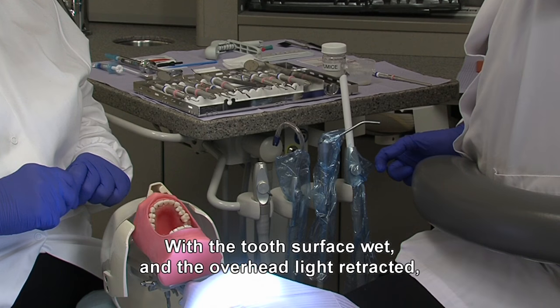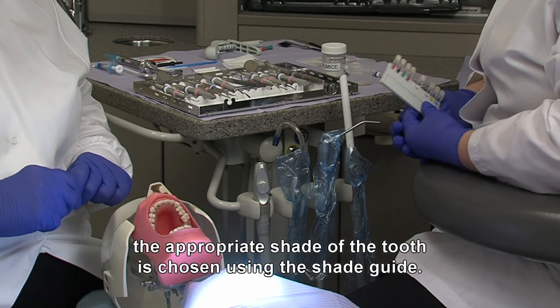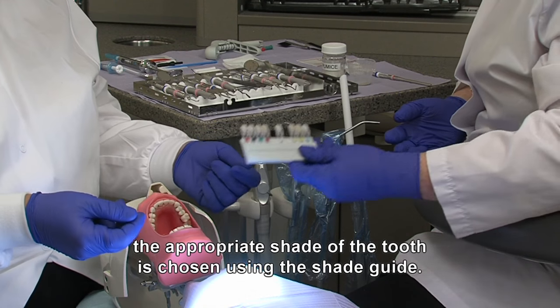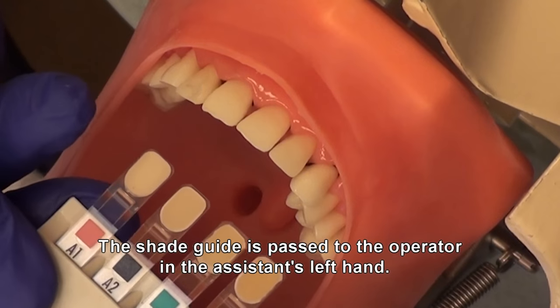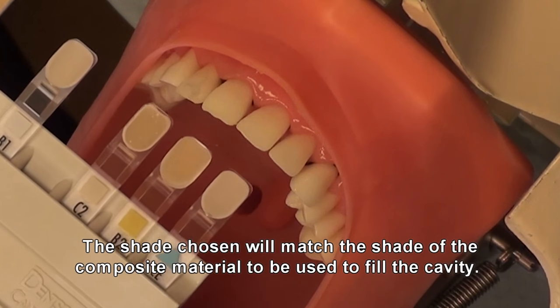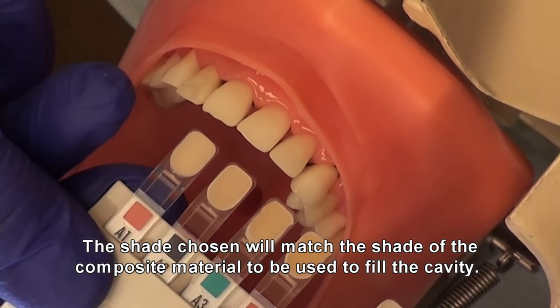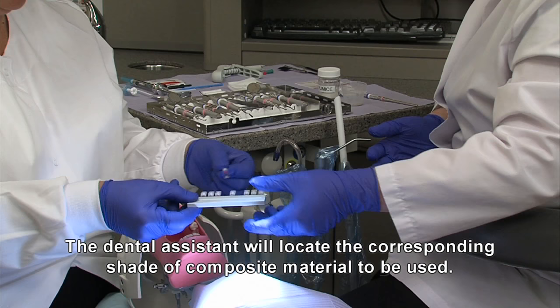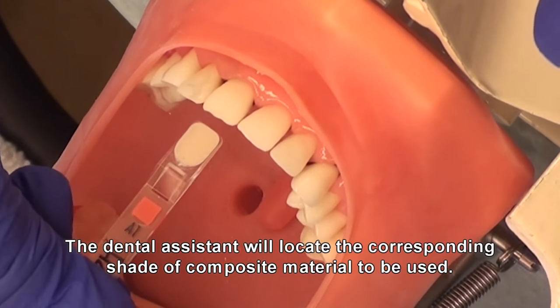With the tooth surface wet and the overhead light retracted, the appropriate shade of the tooth is chosen using the shade guide. The shade guide is passed to the operator in the assistant's left hand. The shade chosen will match the shade of the composite material to be used to fill the cavity. The dental assistant will locate the corresponding shade of composite material to be used.